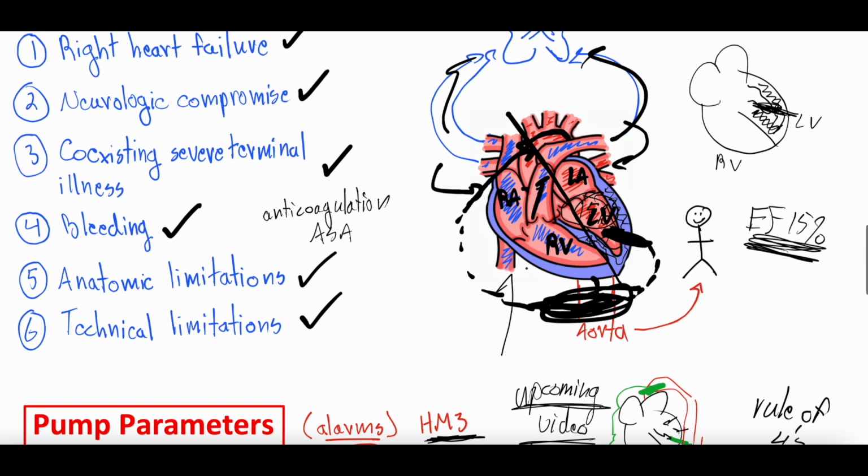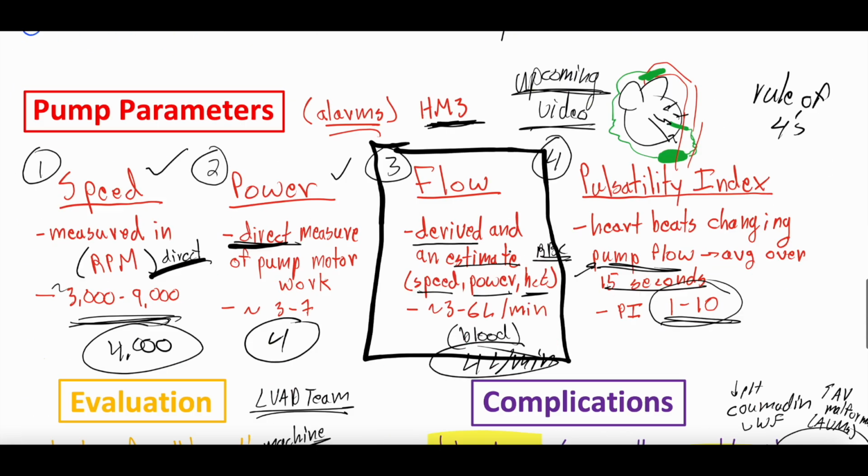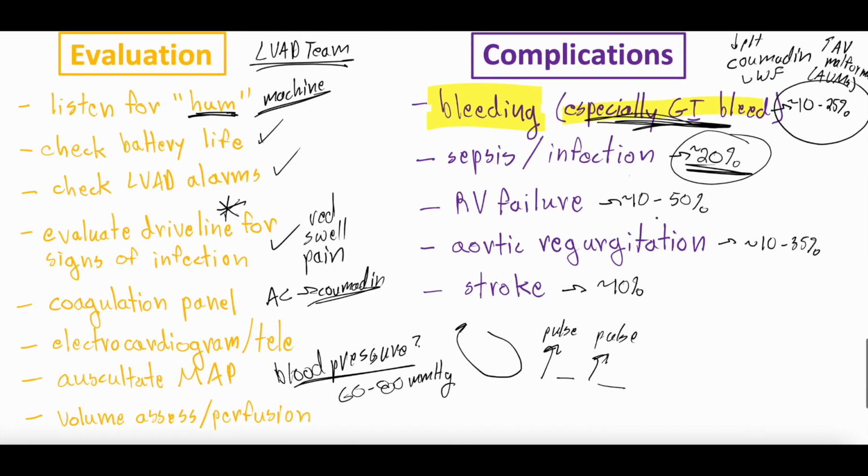But that blood comes back to the right side of the heart. So if the LVAD is doing its job and it's flowing a great amount of blood back, over time it can overload the right side of the heart. And we see that up to 10 to 50%, so kind of a wide margin of patients can get RV failure over time because that LVAD is circulating so much blood around the body, and all that blood goes back into the right side of the heart, and it can cause that right ventricular dysfunction.